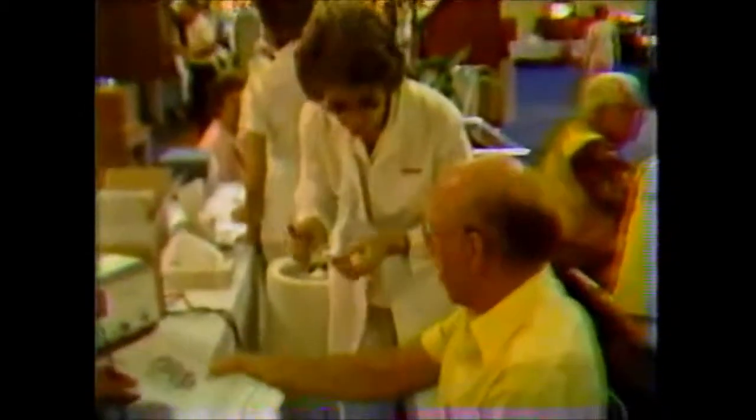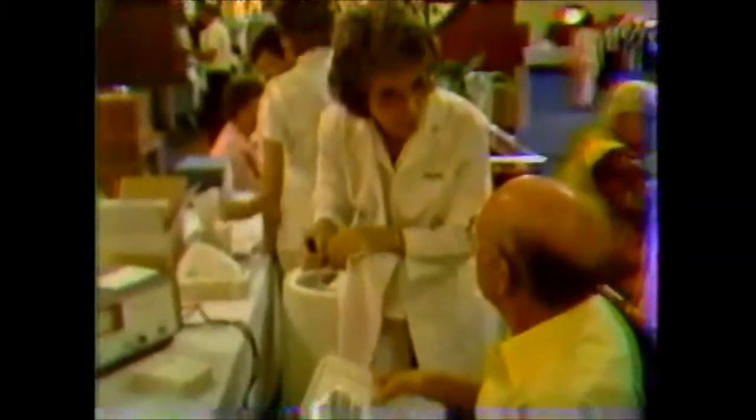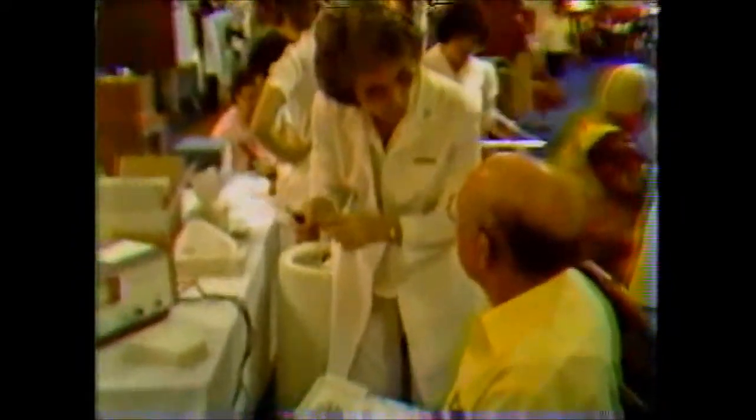Okay. Another eye test being conducted at the health fair this year was the one for glaucoma, and registered nurse Barbara Smith told us about the procedure. I'll put a drop in each eye, and the drop numbs the eye while I test you. Okay. You won't feel a thing. They always say that. Close. Keep them closed till they stop tearing. Okay. I like to cry a lot.